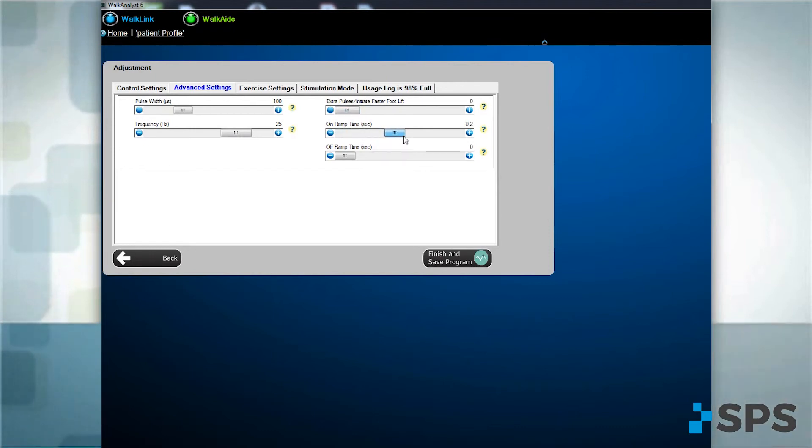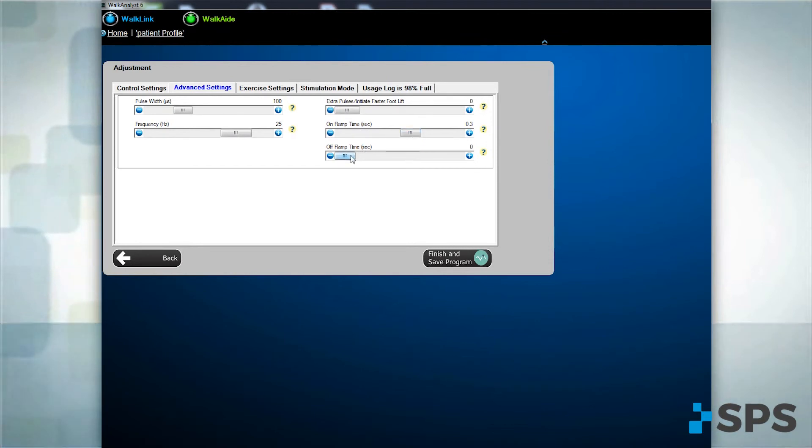Add an on-ramp for a more comfortable, gradual dorsiflexion or to inhibit spasticity in response to the stimulation.